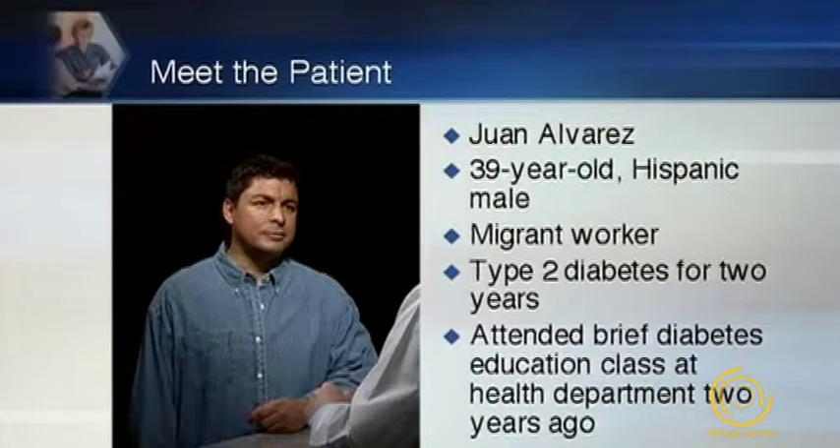Our next patient is Juan Alvarez. He's a 39-year-old migrant worker who has had type 2 diabetes for two years and attended a brief diabetes education class at his local health department two years ago. Good afternoon. Is he the pharmacist? Yes, I'm the pharmacist. What can I help you with? Thank you. I'm Juan Alvarez. I have a few questions about the glucose tests.